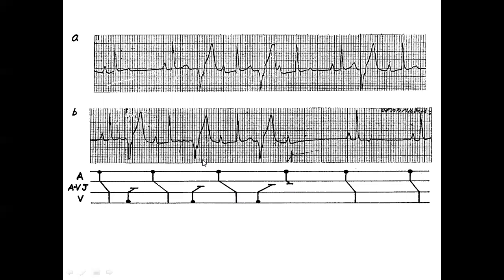So nobody should think, oh, this patient has a second-degree AV block. No, it's the trick the PVC is playing. This patient has nothing wrong whatsoever in the AV conduction system.